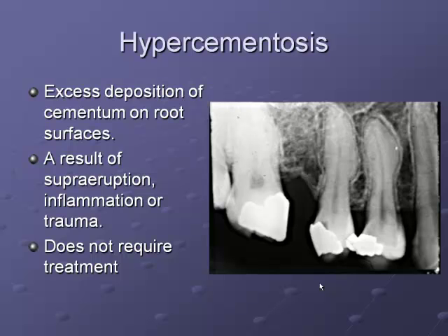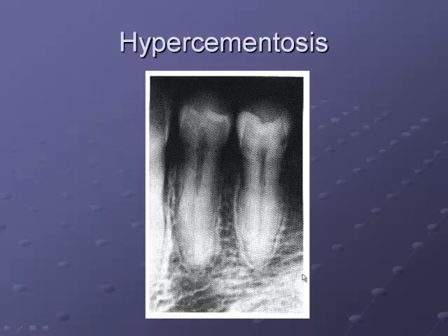Lastly, we will discuss hypercementosis. It's the excess deposit of cementum on the root surfaces, a result of supereruption, inflammation, or trauma, and does not require treatment. In this radiograph, you can see the excess deposits of cementum on the root of this premolar.